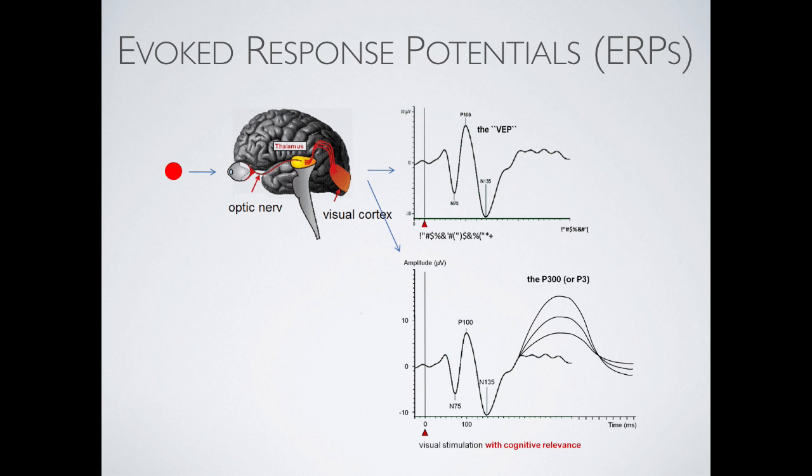Only when it sees the one you're looking for do you get what we call the P300. P stands for positive, this is very simple nomenclature here, and 300 for the time delay at which the peak occurs. So this is 300 milliseconds after the stimulus. And the key being that if it's the thing that you're expecting to come, you get a P300. If it's not, your brain doesn't produce that potential.